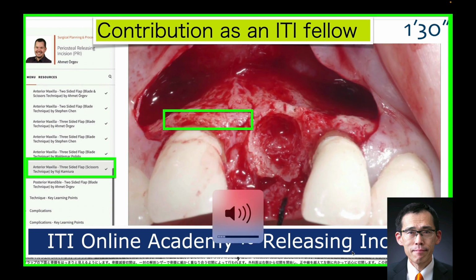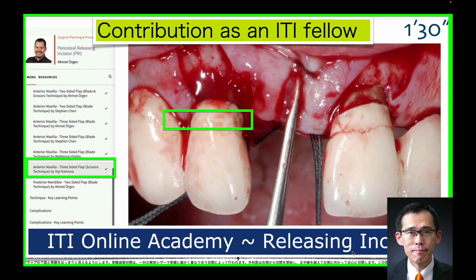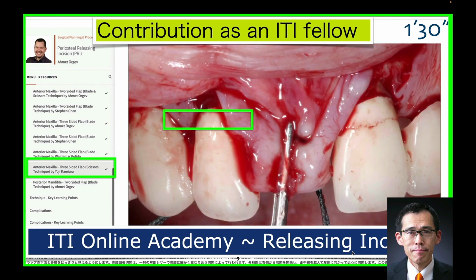A full-thickness mucoperiosteal flap has been raised with vertical releasing incisions adjacent to the right central incisor and left lateral incisor. The flap is extended apically beyond the mucogingival junction. A black silk retraction suture has been used to maintain reflection of the palatal flap. Using a second retraction suture and fine tissue forceps, the flap is gently pulled buccally, providing clear visibility of the undersurface of the flap.